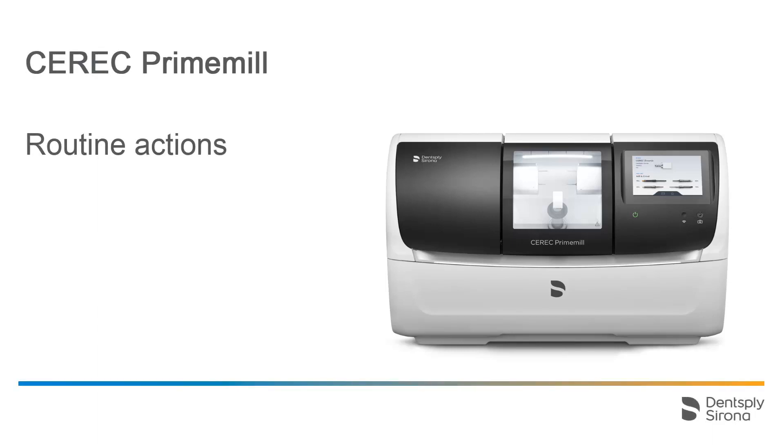Welcome to this video tutorial on the topic of CEREC PrimeMill. In this video, we will guide you through the Routine Actions options in the Touch interface.